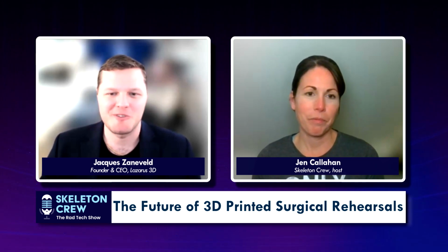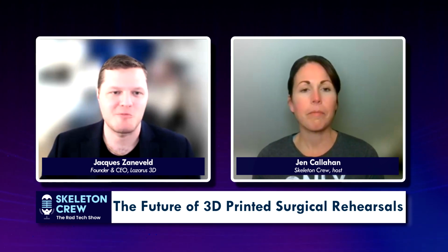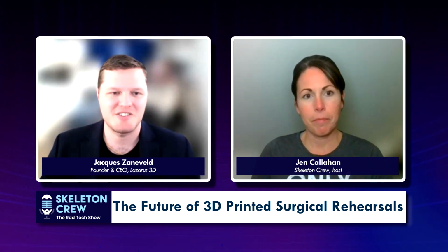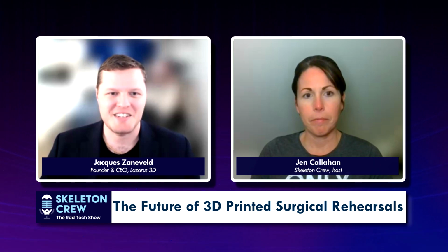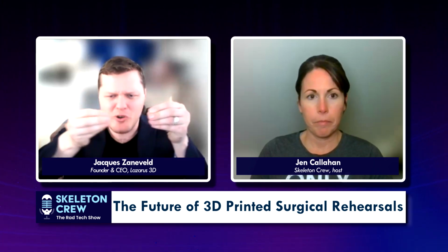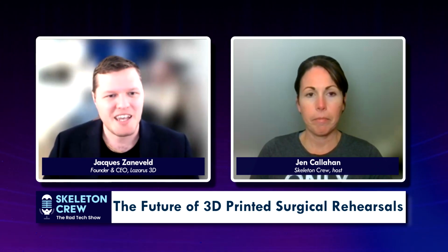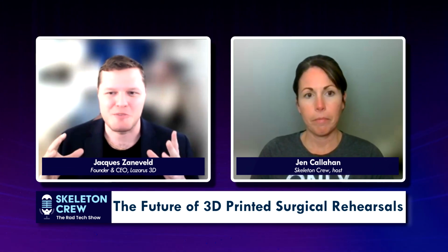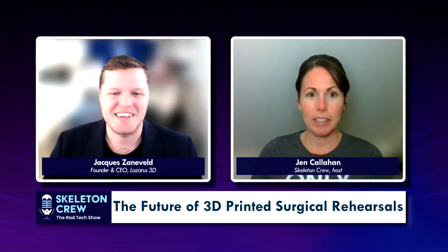In particular, we recently received an award from the NIH, a grant to support research together with Texas Children's and University of Oregon, which is allowing us to further investigate some of the material property questions surrounding our models. And so there are all sorts of tests that you can do where you take little samples and you pull them apart and you make indents on them using machines, and all sorts of mechanical engineering that goes into trying to determine, well, what exactly does a bladder feel like? And then trying to recreate that in a synthetic model.